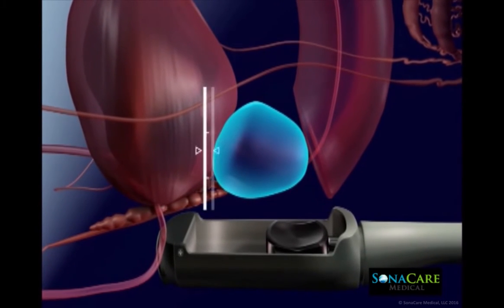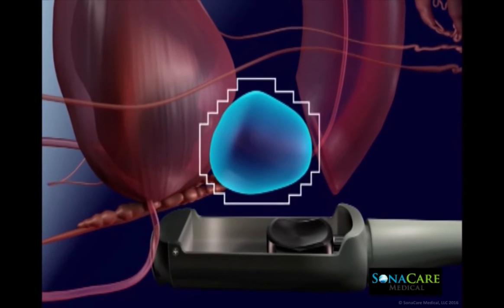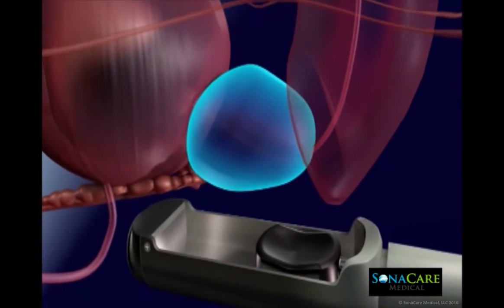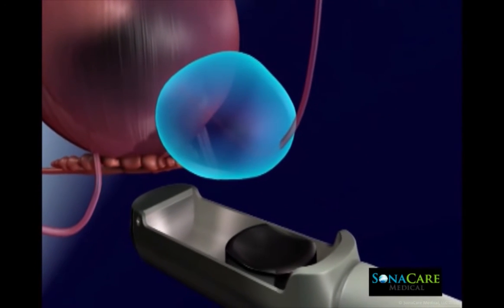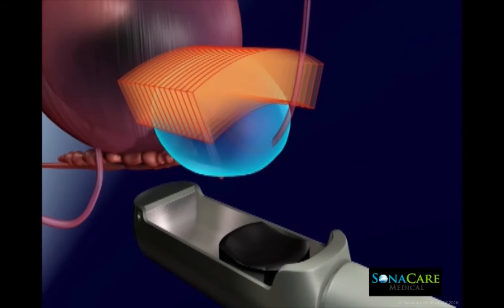In preparation for ablation planning, the Sonoblate imaging transducer maps the morphology of the prostate gland in real time. This allows the physician to create a customized plan for the procedure in multiple ablation zones.